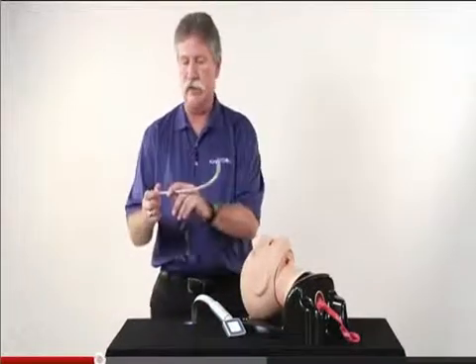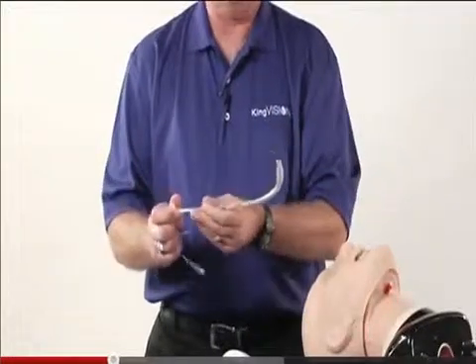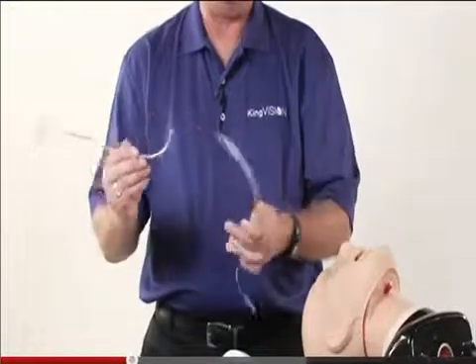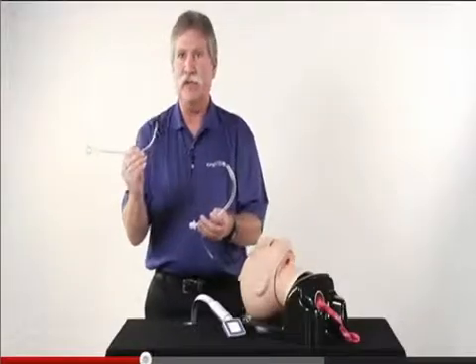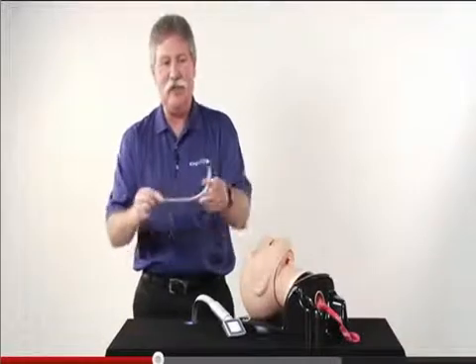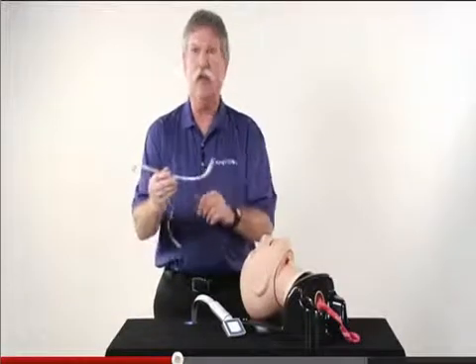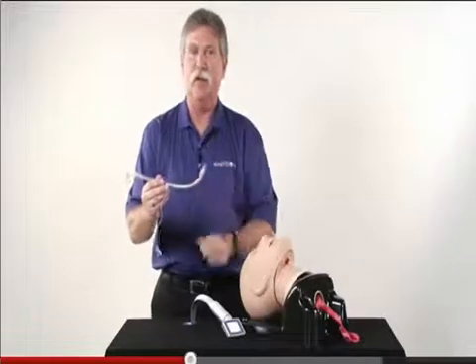First of all, when it's installed, you want to make sure that the tip doesn't stick out the end of the tracheal tube, because that's more likely to be traumatic. It's also very important to make sure that the stylet is lubricated ahead of time to make it slide in and out very easily. Also, you don't want to form the stylet to give you the curvature. You want to do the stylet inside the tube, because it may give you a little bit different curvature because of the sloppy fit. Typically a 60 to 70 degree angulation of the stylet, maybe 2 to 3 inches from the end of the tube.